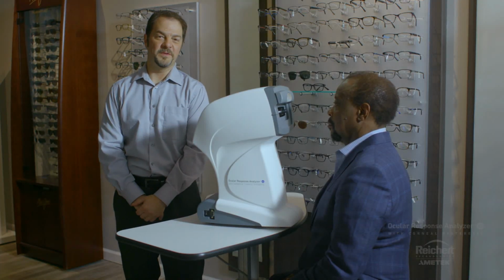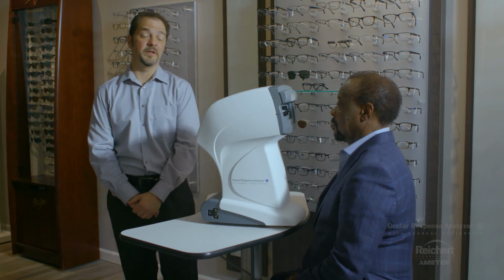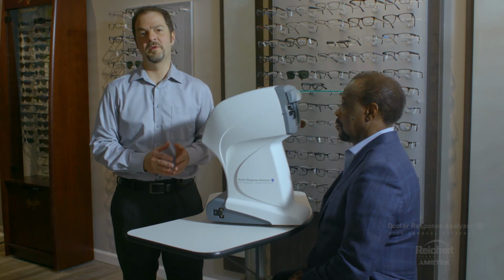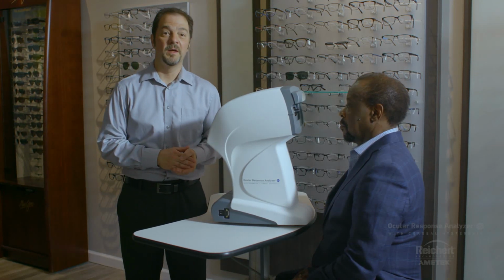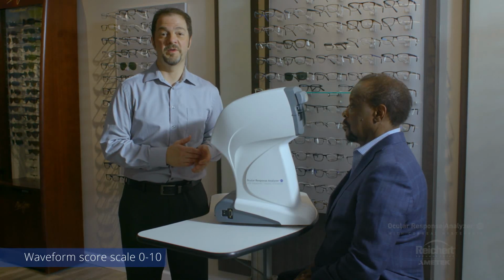Let's talk for a few moments about the Ocular Response Analyzer waveform score and the use of averaging in the Ocular Response Analyzer. The waveform score is a tool that's used as a reliability index. It should help you determine if you've made a good measurement or a not so good measurement, very much like a signal strength indicator on an OCT. It's on a scale of 0 to 10, and the higher the number, the more reliable the measurement data are.